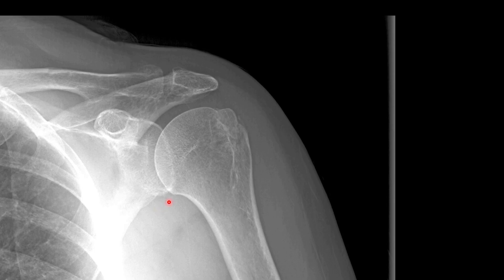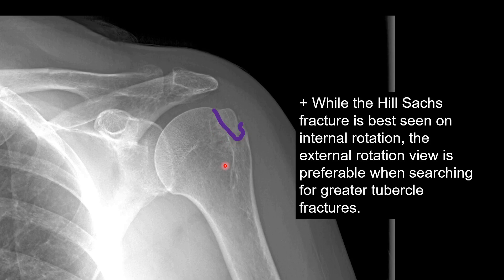This patient presented with shoulder pain following some sort of trauma. If you follow the contours of the humeral head, you can see that there is a fracture of the greater tubercle. Pathology of the greater tubercle is best assessed on the external rotation view, whereas the internal rotation view is preferable to spot the Hill-Sachs defect. The greater tubercle serves as the insertion site for three of the four rotator cuff muscles: the supraspinatus, infraspinatus, and teres minor muscles.